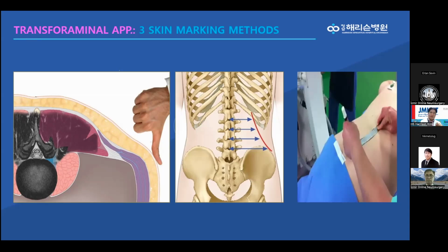But you know that this technique is very safe in two points. One point is visceral injury. The second, more important point is that it is very safe from dorsal root ganglion damage. Because of that, some doctors try a less angled approach to the target point, but sometimes it causes dorsal root ganglion damage, and then post-operative dysesthesia or post-operative weakness may happen. But if we use this technique, that problem usually does not happen.